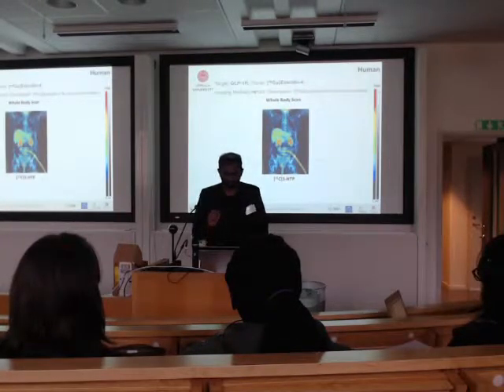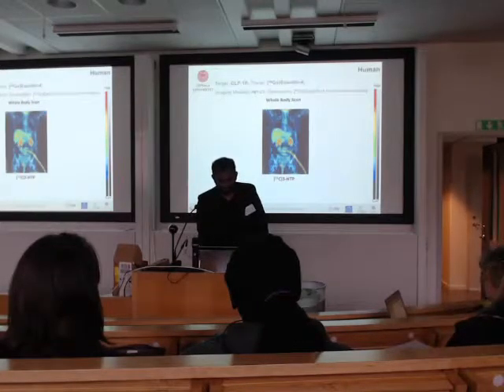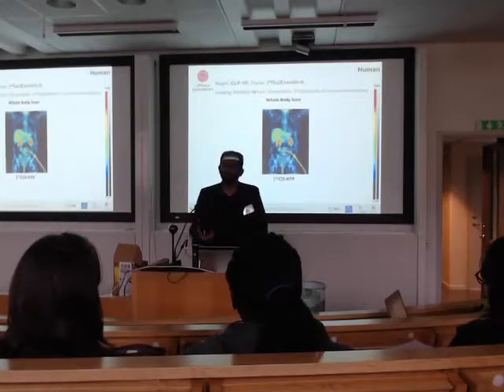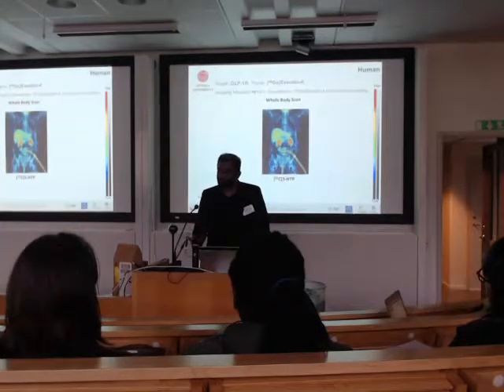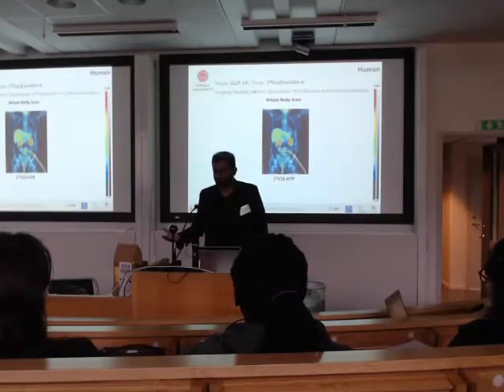Then what they did was the carbon-11 5-HTP scan. The primary tumor is in the pancreas, the metastasis is in the liver. But it's everywhere in the liver, so you can't look for the metastasis. If you don't know the extent of metastasis, you cannot start any therapy, even chemotherapy, right? So they couldn't even detect where the primary tumor was. In that case, they cannot do the surgery. They don't know the extent of metastasis. They cannot start the chemotherapy.